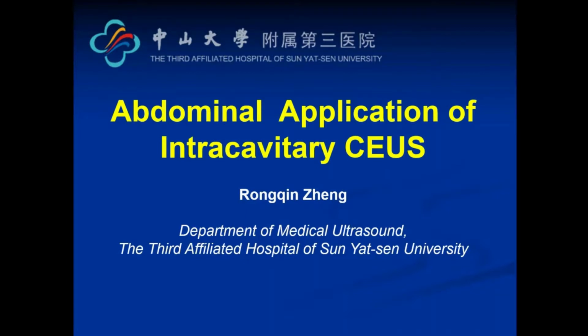Intracavitary contrast enhanced ultrasound, that is ICCEUS, is to inject diluted CUAs into physiological or non-physiological cavities, and is considered as a useful problem-solving tool. It has been recommended by EFSUMB to identify needle or catheter position, to delineate any cavities or ducts, and to improve tracing of a fistula.